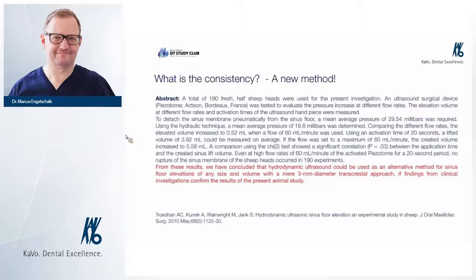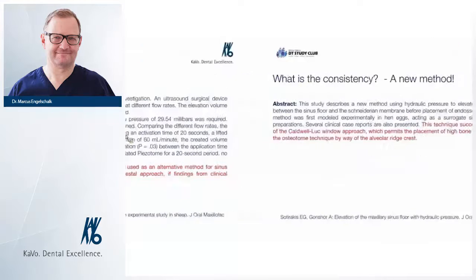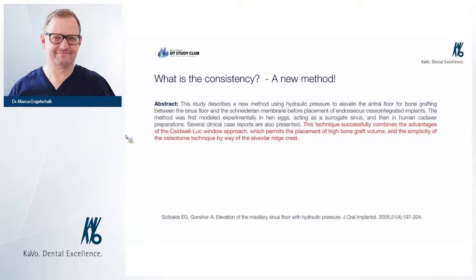It's not at once, it's oscillated, and then you can remove the membrane. Well, this is the picture from the treatment later on. You see the amount of bone, you see the implant, and you see that we lift it until the palatal side. Well, there's bone everywhere around the implant.